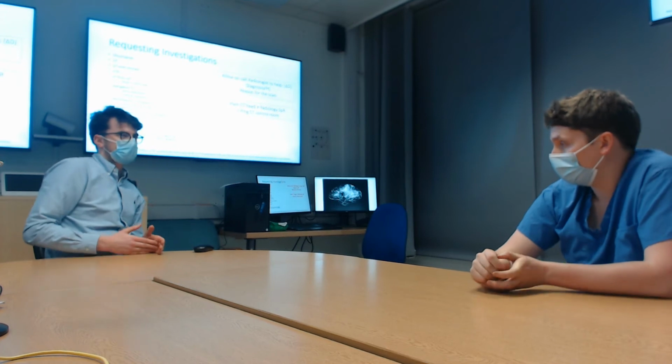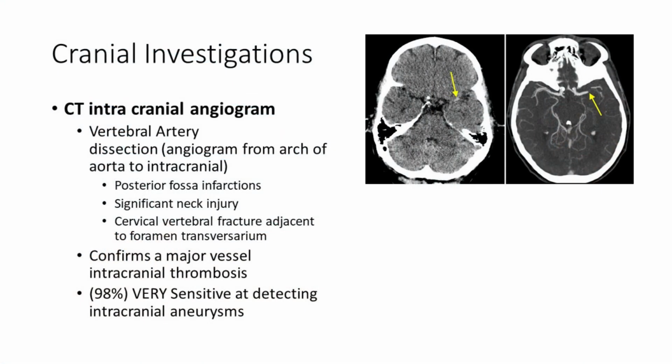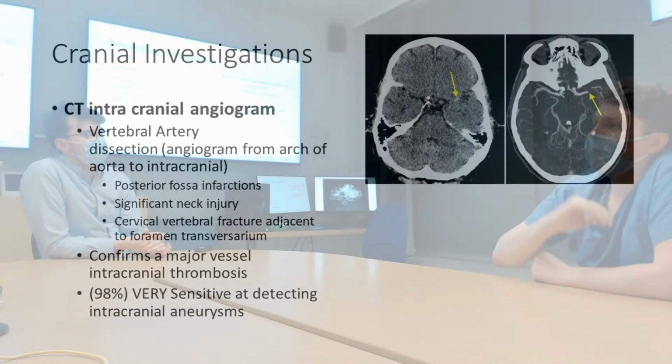But a CT angiogram, it's quite important to differentiate this from a DSA, even though they are obviously often used to assess the same thing. A CT angio is done by radiology in the radiology department, by a radiographer, in the CT scanner. Effectively, you get a green cannula in the ACF to get a good flow rate on the injection of contrast, and then they time it on some CT cuts, and then they'll start scanning with the contrast in the arterial system.